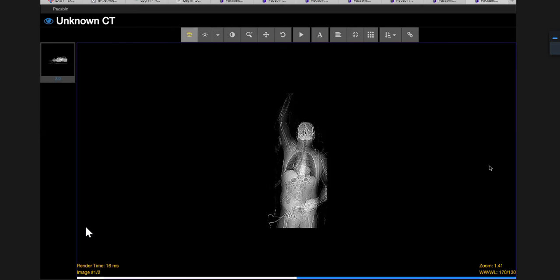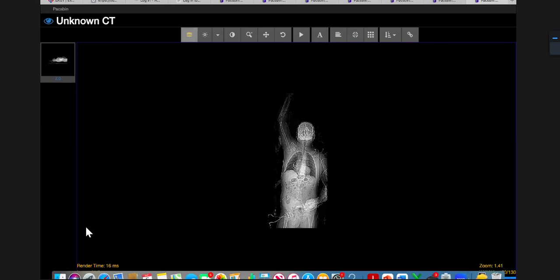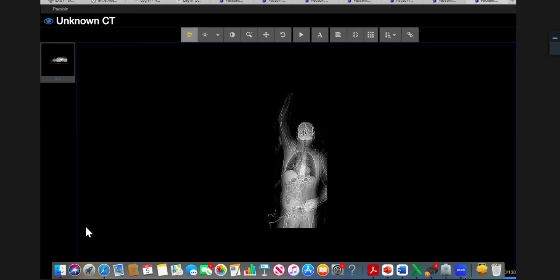So one bolus is in the arterial system and one in the venous system, and you get a picture of both together. And as you say, sometimes if clinically they want the limbs done, we'll do that too. So that's the Camp Bastion protocol.